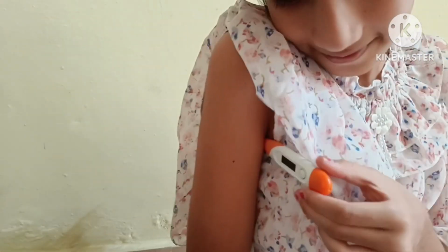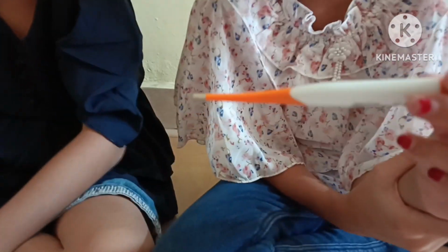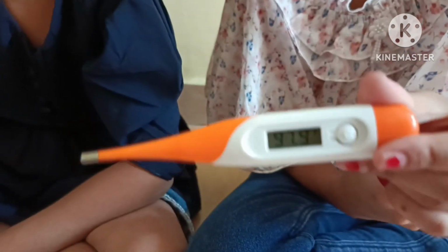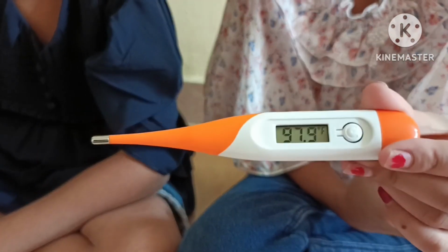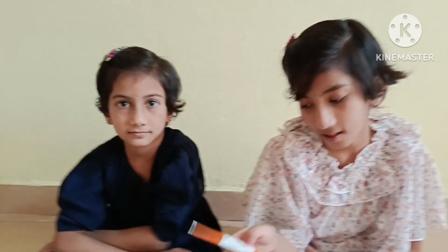Now beep sound came. My temperature is 97.9. It is normal temperature.